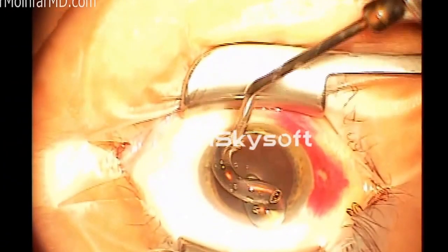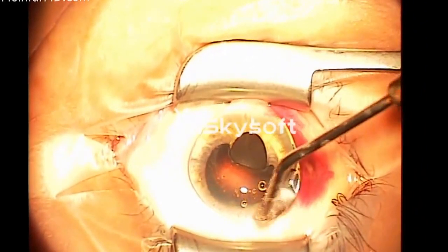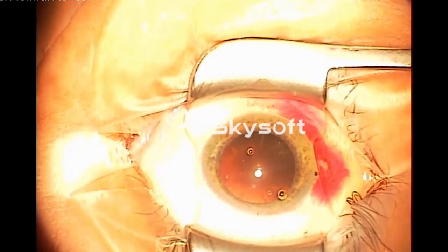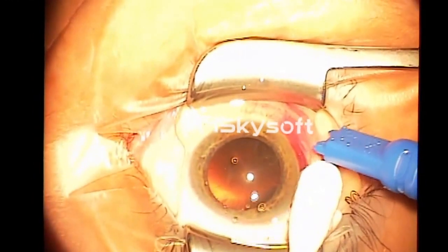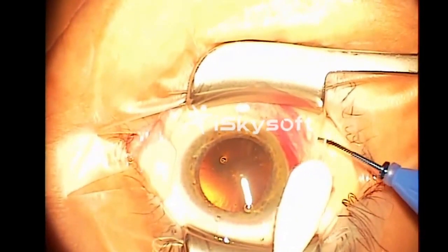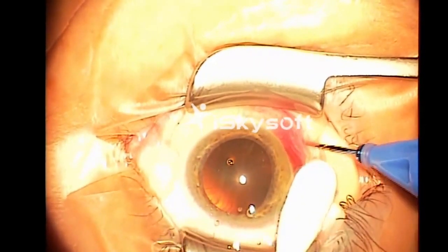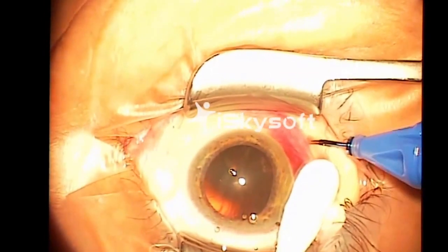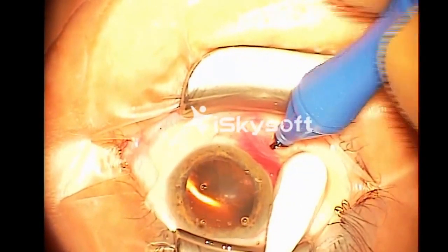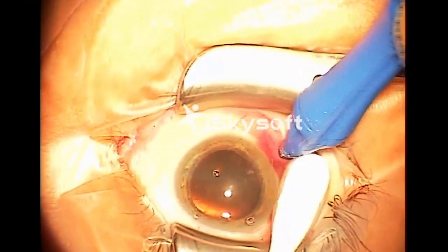Hi, this is Nader Moinfar, and this video is a surgery for a patient that has a condition known as proliferative diabetic retinopathy. You may recall that diabetic retinopathy can occur with different levels of involvement of the eye. One of the more aggressive forms is a state known as proliferative diabetic retinopathy, and I'll address that with a little bit more detail in a few moments.